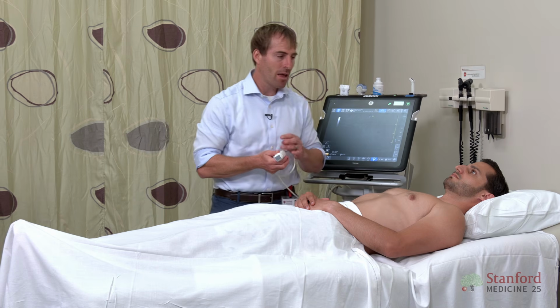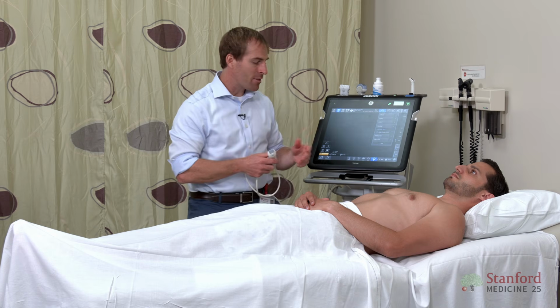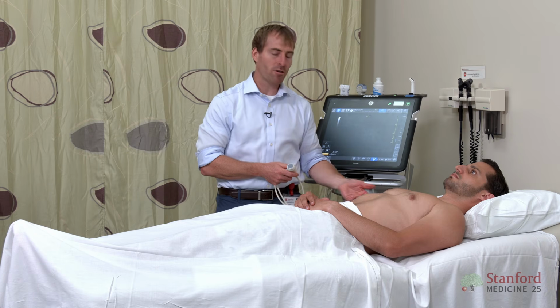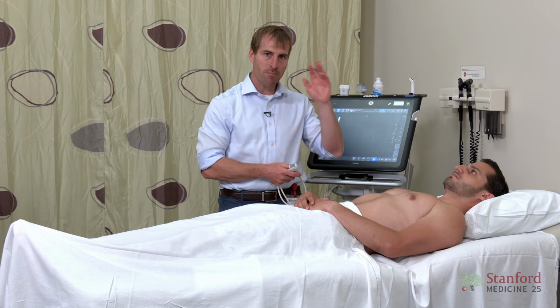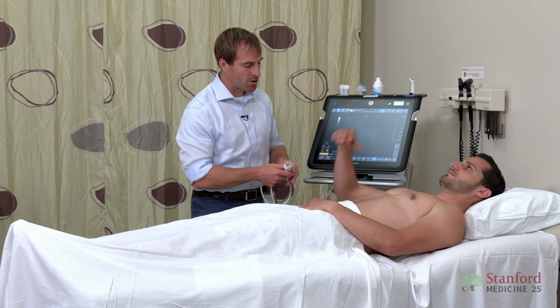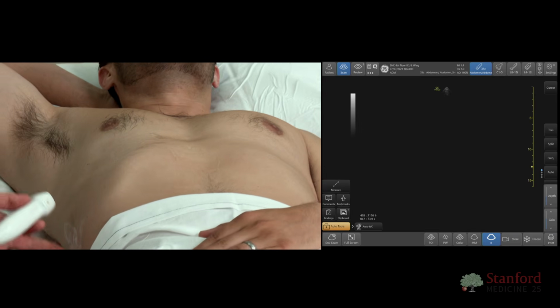Now let's say this isn't working either. You've got one more shot. And to do this, I'm actually going to switch us over to abdominal mode, okay? And the reason for that is, you could do it in cardiac, but I'm so used to being over here on the mid-axillary line. I'm always looking for pleural effusions there. My brain is just set to always be in abdominal mode when I'm in the mid-axillary line. It just helps me out a lot. So I'm going to have my patient go ahead and place their arm behind their head, all right? And now I'm going to be looking right along the mid-axillary line.